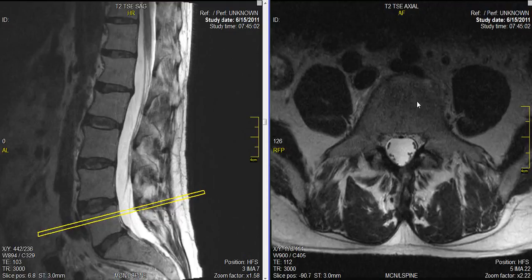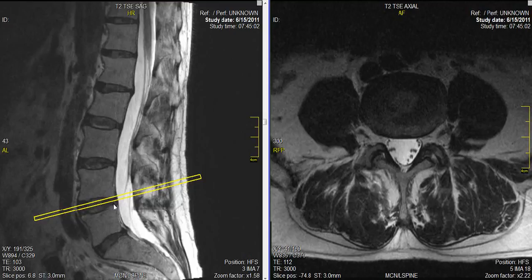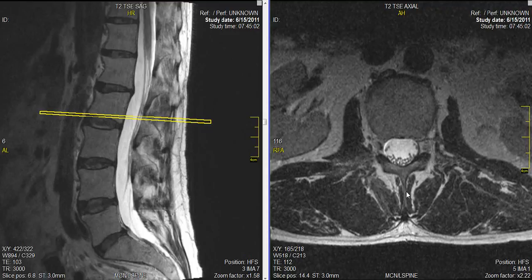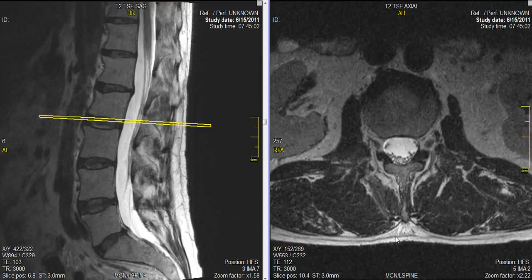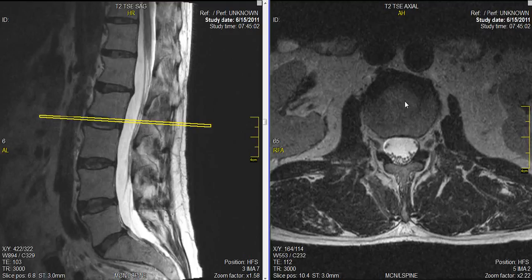Now we're going to jump over to the other set of images. These are called axial images — they are cross-sections. This is a slice or series of slices, and the level is demonstrated by the yellow line on the other picture. Each one of these images is oriented as if the person is laying on their back and we are looking up from the direction of the feet. So now this is the back, front, right, and left. These are the back muscles, these are the kidneys, and this is the spine. This part here is the bone or the disc, depending on where the slice is.